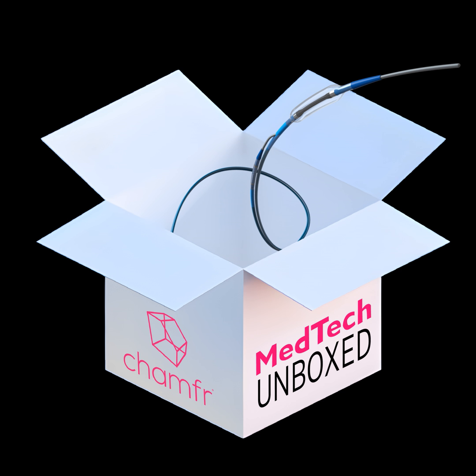Yeah. Well, that was good. That was the next question I was going to ask you. What's the value prop or the key there? I think it is really to shorten that design cycle. Also to do kind of a simulated DOE, right? Absolutely. With the software, you can set your parameters, you design your catheter, and then I have this module I added that I'm very excited about. You can select any two parameters, and it will run a full virtual DOE for you, hands off, and give you a response surface you can then navigate and quickly hone in on the design you want.